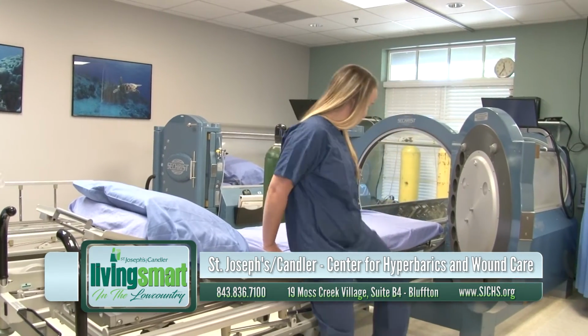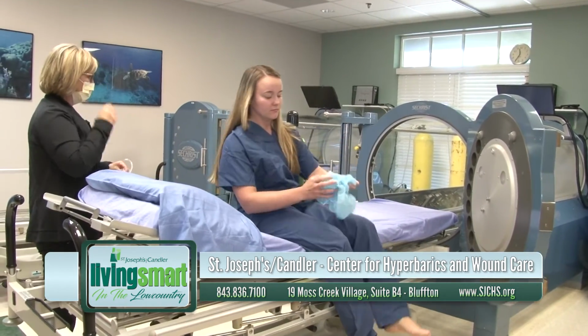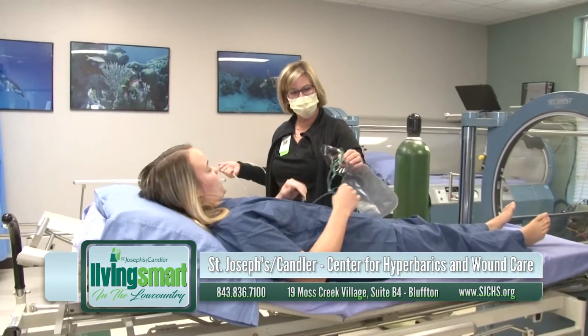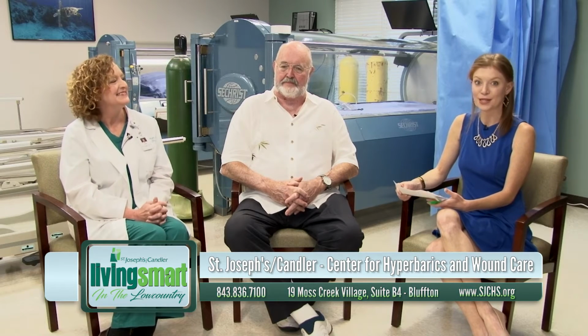Okay, now the specifics about what do we actually do to get ready to get in, because we learned a little bit about the science behind this machine. And so there's some things you need to know before you actually hop in the machine. What do we need to know? Well, number one, a patient needs to have scrubs on, and they are not allowed to have any kind of metal on their clothing because our machinery is very expensive and it can actually scratch our equipment very easily. So no earrings, no zippers, so that's why it's important that when the patient gets here, we'll have them go into our room and put a pair of scrubs on and make sure they remove all their jewelry or whatever before they go into the machine. Okay, so some details we don't want to forget about.